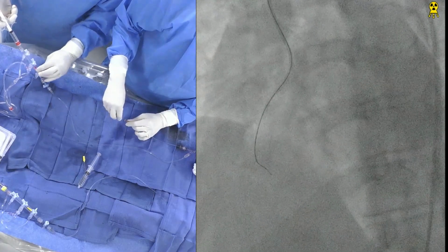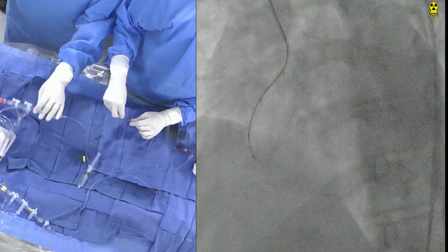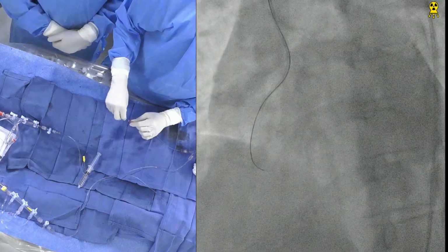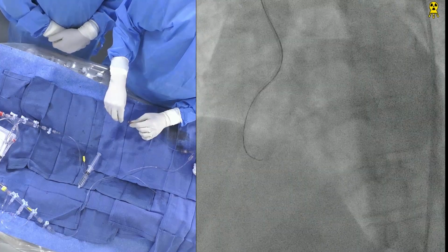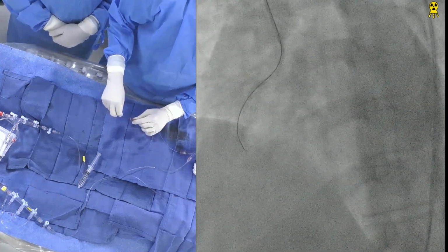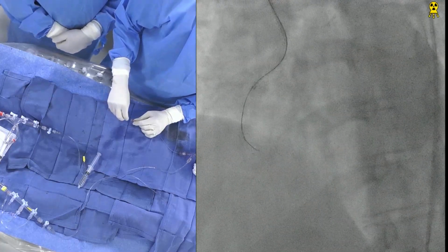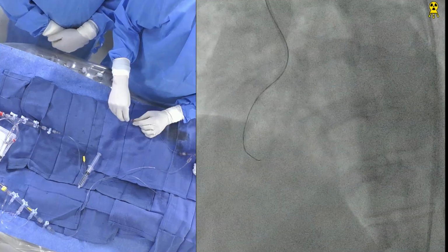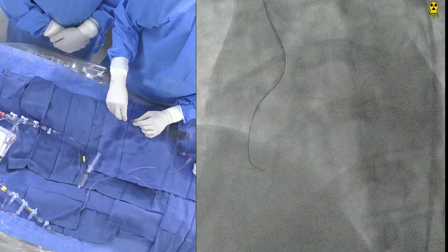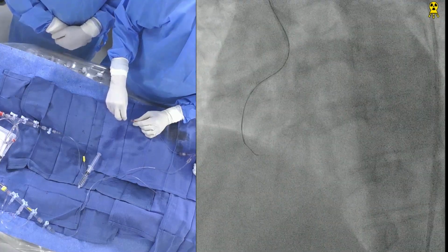This patient is on Plavix because of the CTO. We try not to give stronger P2Y12 agents if we're working on a CTO because they have more chance of wire perforations, so we use the PRU. The PRU has been done and it's 119. Anything less than 230 is good, so we don't need to change it. Although my personal inclination would be to change it to prasugrel after we successfully recanalize the RCA CTO, leaving it on clopidogrel is completely okay also.